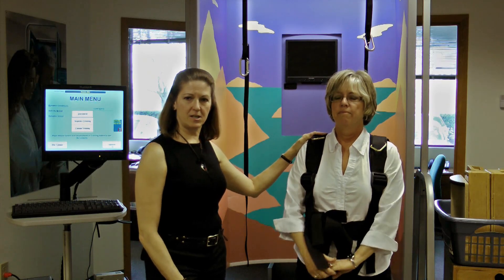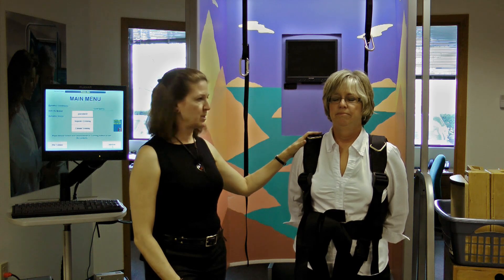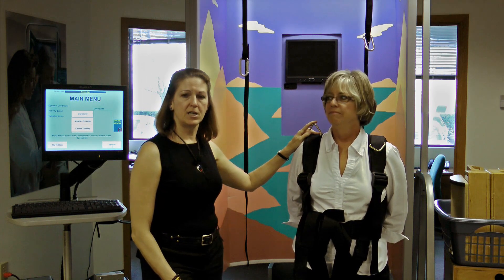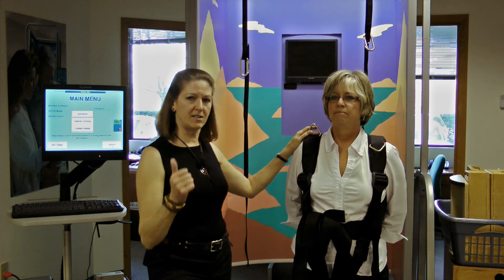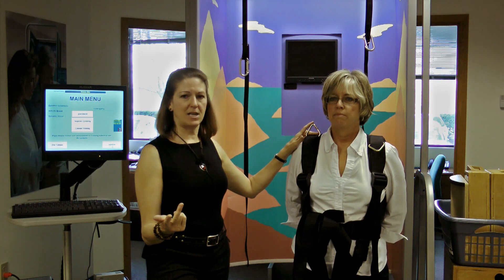We are going to be testing a 55-year-old woman on the Neurocom Smart Equi-Test. We're going to be performing three tests of balance and stability called computerized dynamic posturography. That includes the sensory organization test, the motor control test, and the adaptation test.